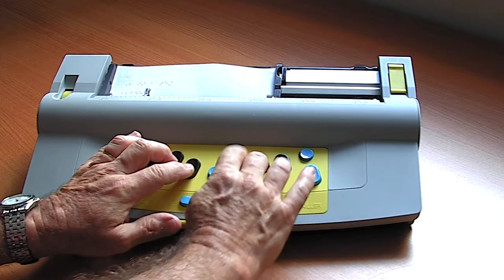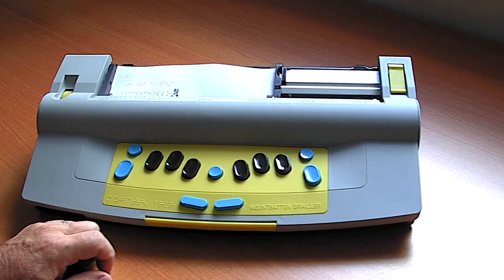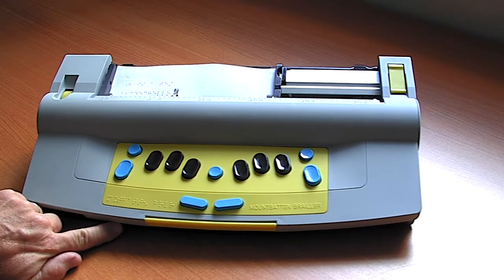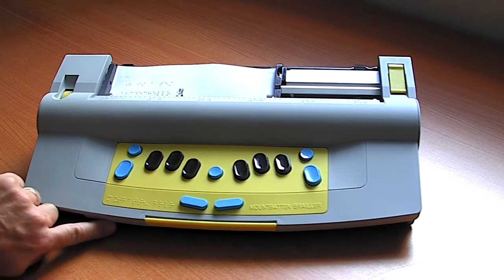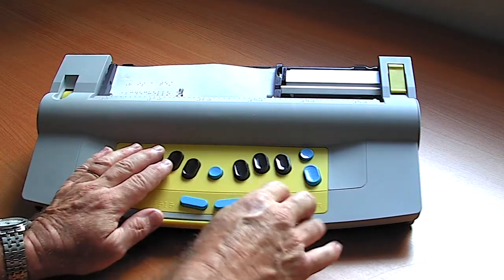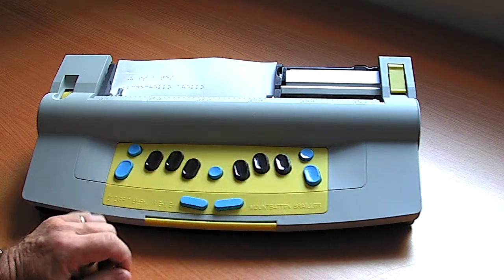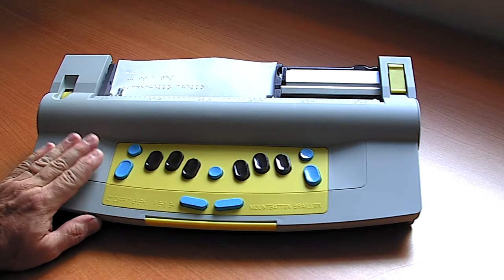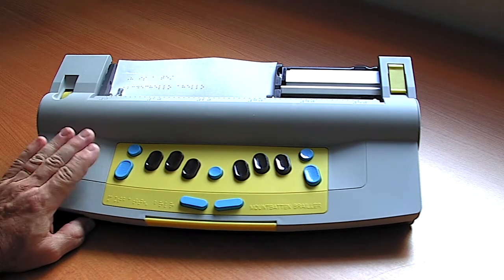I'll reduce the speech volume down by turning the wheel, right down to nothing, and then we'll just listen to the actual volume of the Mountbatten. In whisper mode it is actually a lot quieter than a conventional classic Perkins Brailler.